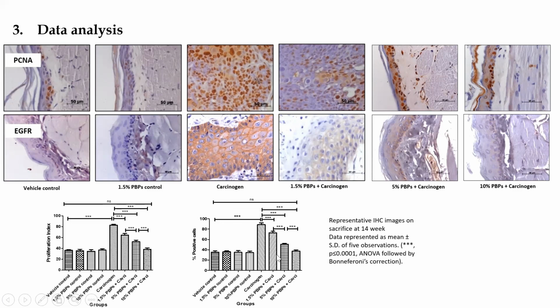So here also, similar to Western, I have not explained to you, in case of IHC, we have taken average percentage positive cells from 5 animals. And for each animal, one IHC slide is there. From one animal, we take the tissue, and for that tissue, we perform IHC. So from one animal, technically we have one slide. Now for that IHC slide, we take 10 images. From those 10 images, we count 1,000 cells. Out of those 1,000 cells, the ratio of positive to negative cells can be anything. Then we calculate percentage positive cells.